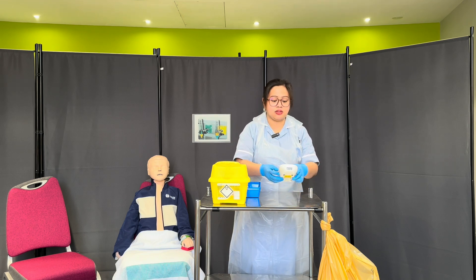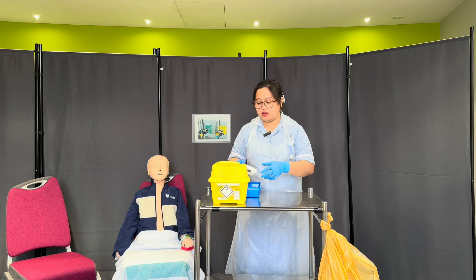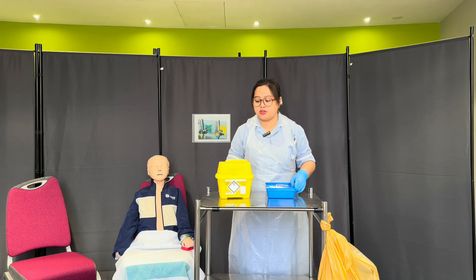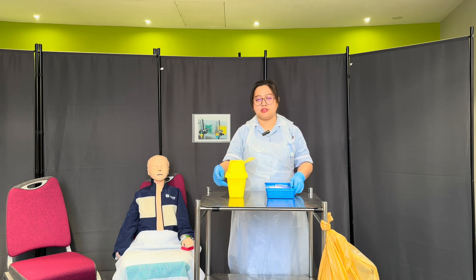Examiner, can you confirm if my glucometer has been calibrated and cleaned within 24 hours? Yes. Thank you, so I'll be happy to use this. I have here my sharps bin — it's less than a quarter full and it's clean and dry, so I'm also happy to use this.